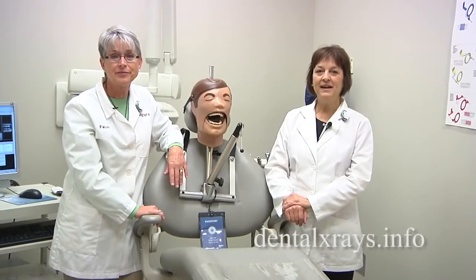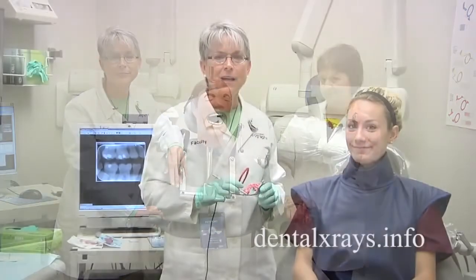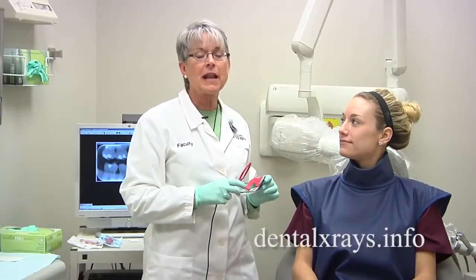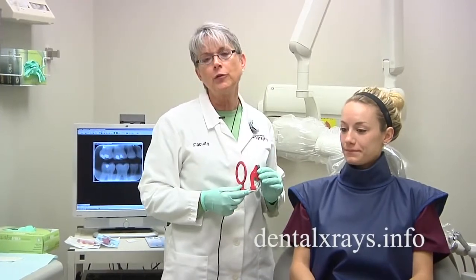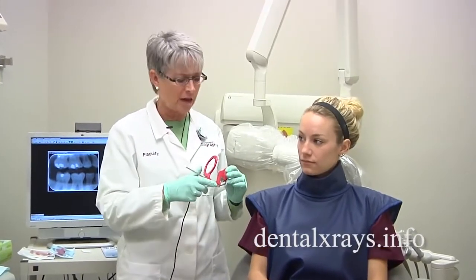Hi, I'm Sherry Ortiz and I'm Vicki Romans from Ask the Experts on dentalxrays.info. We've had a lot of questions about how to get bite wings to include the distal of the canine using a sensor on a narrow arch, or actually any arch at all.